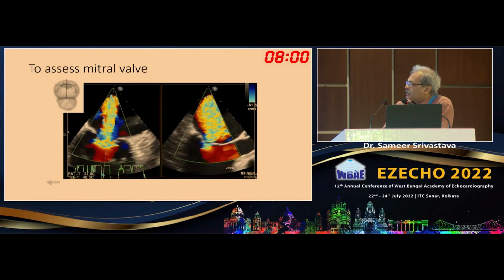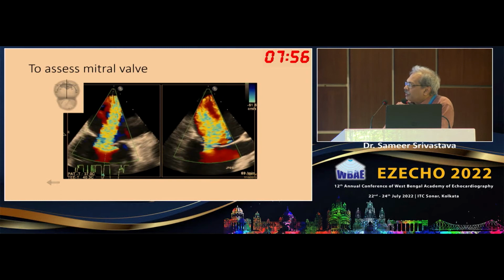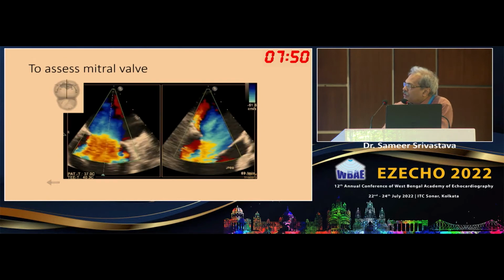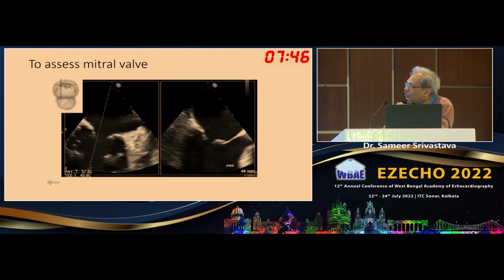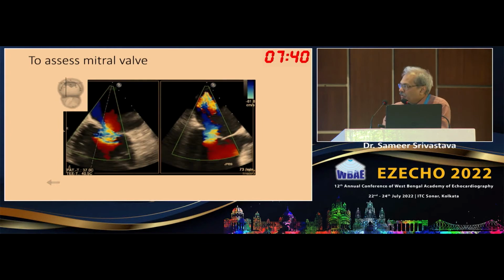Here it's huge, big-time mitral regurgitation, and now we'll start assessing it. If you look at this bar, it will keep changing from its assessment. When you keep rolling it sideways, you'll start seeing the leaflets and the scallops which are there.